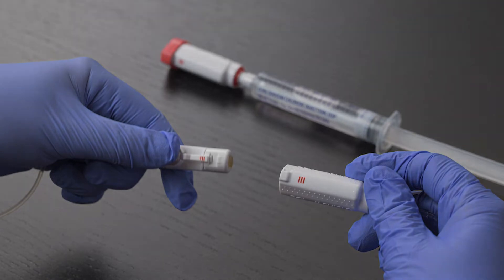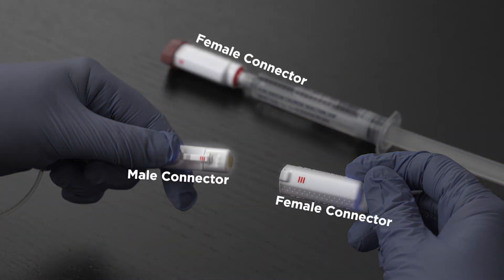There are two parts to the device: the male and female connectors. There is a small red cap on the end of the female connector to keep it clean.